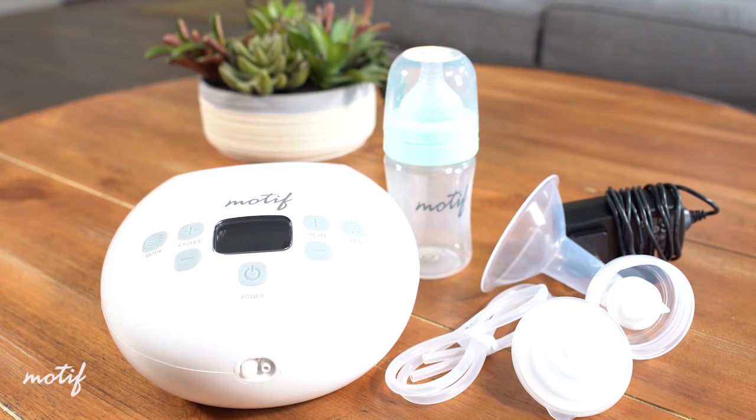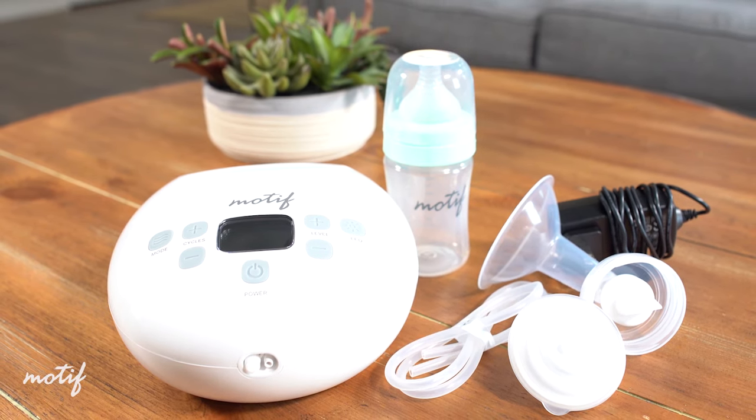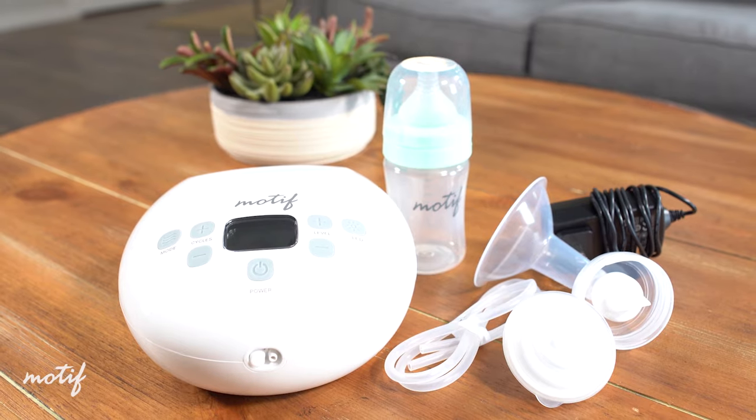Hi, my name is Ashley Georgiakopoulos. I am the lactation director with Motif Medical and an internationally board-certified lactation consultant. Today we're here to talk to you about the latest pump from Motif Medical, the double electric closed system Luna.